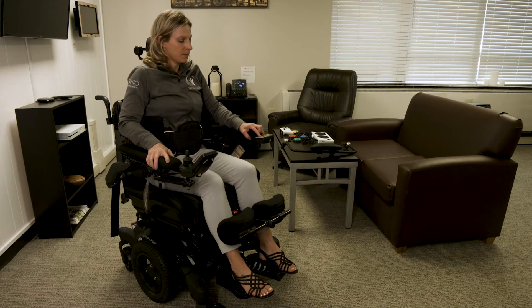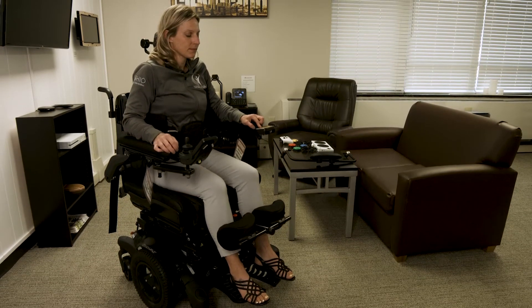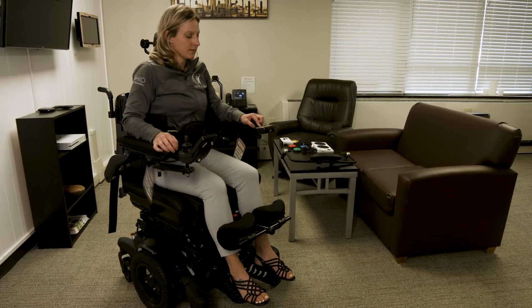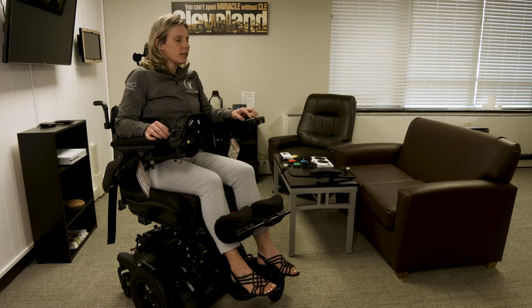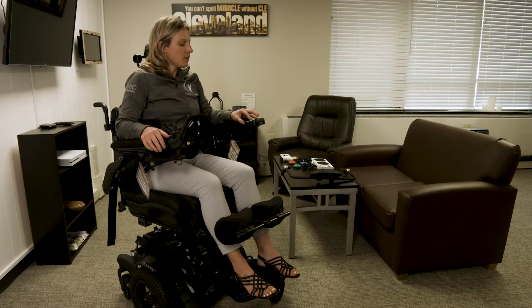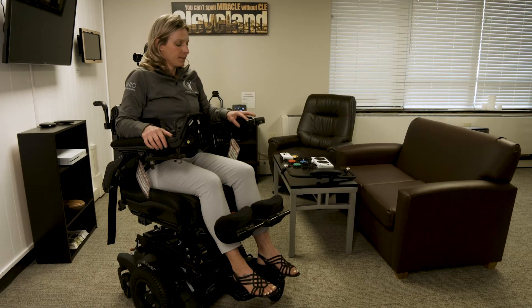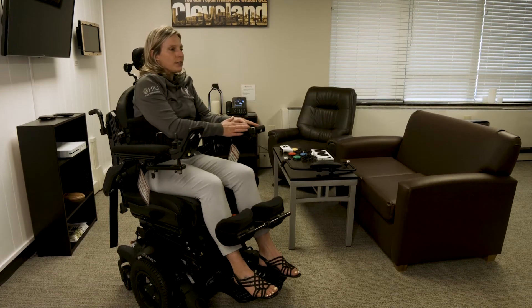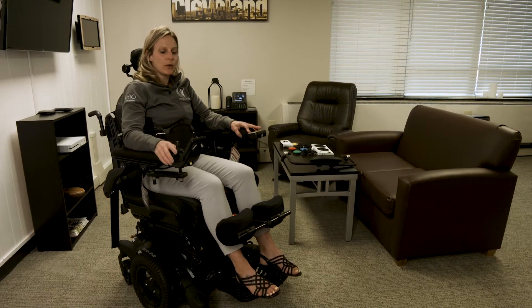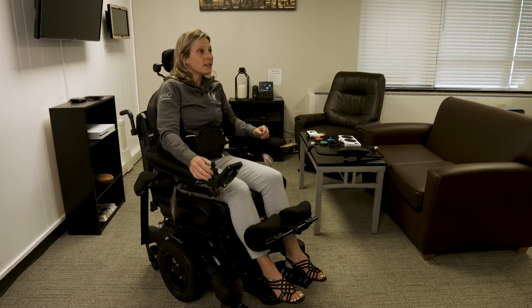The next feature is the recline feature. With this feature, the seat stays static but the back reclines, which opens up your hip angle. There are no preset limits on the range in this chair, so it does become a little bit hard to reach the control, but generally you would stop at your comfort level or have a pre-established stop built into the settings.